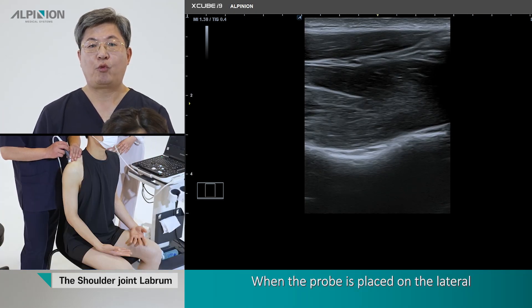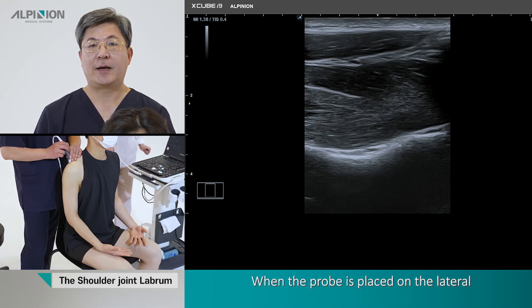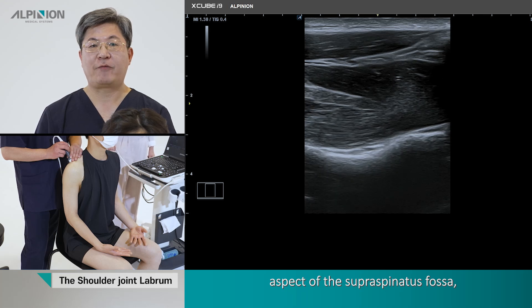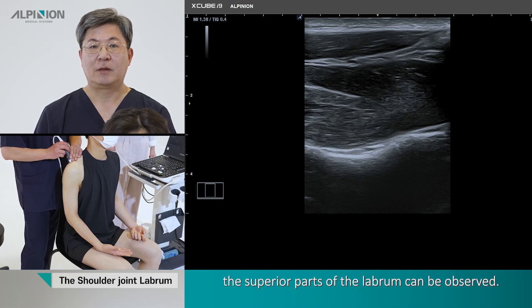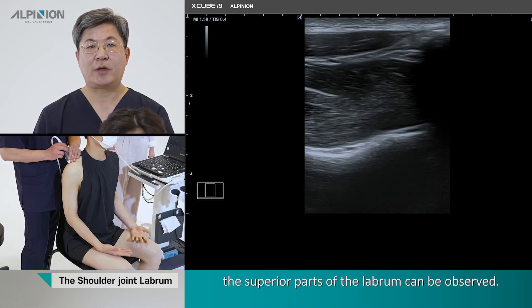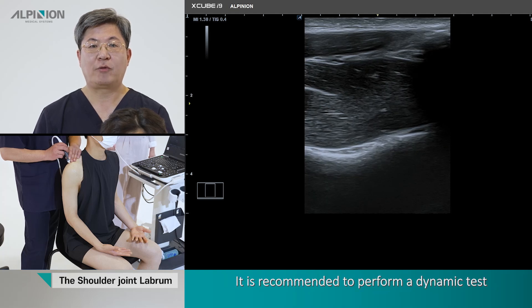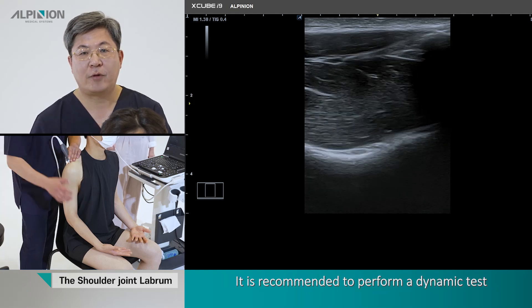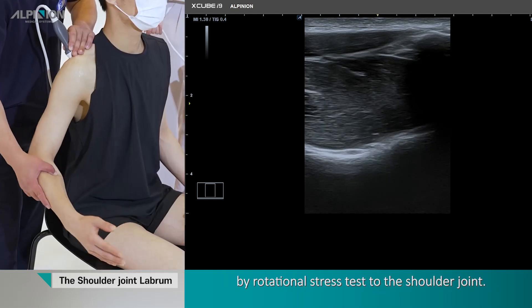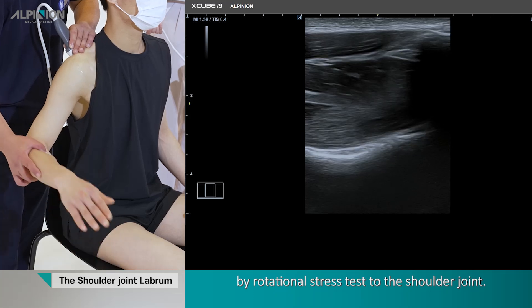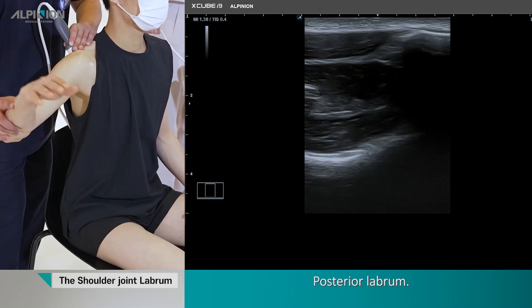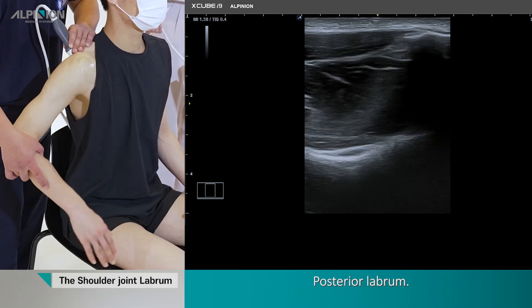Superior labrum. When the probe is placed in the lateral aspect of the supraspinatus fossa, the superior part of the labrum can be observed. It is recommended to perform a dynamic test using a rotational stress test of the shoulder joint.